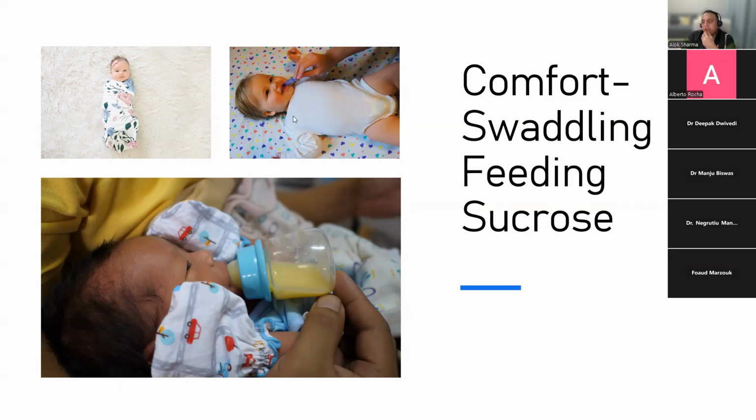I think you're really going to need, and this is an infant, somebody to help contain this baby. Play therapy for infants really helps in that particular situation. But when doing a scan, the best analgesic, in my opinion, is a good feed. It is the best analgesic and the best sedative. It works 100 times better than sucrose.